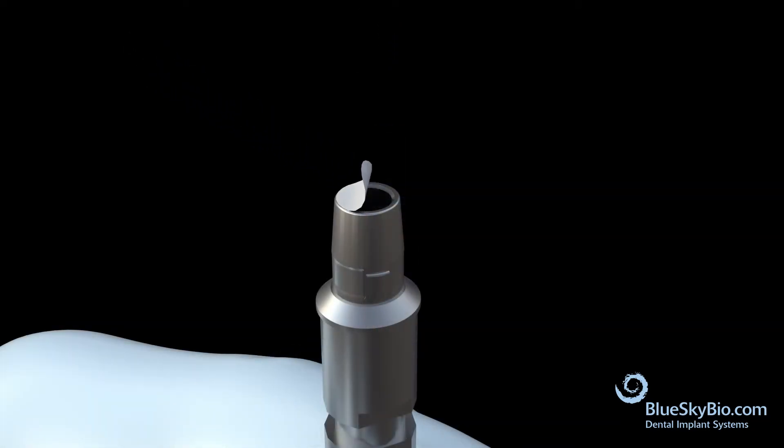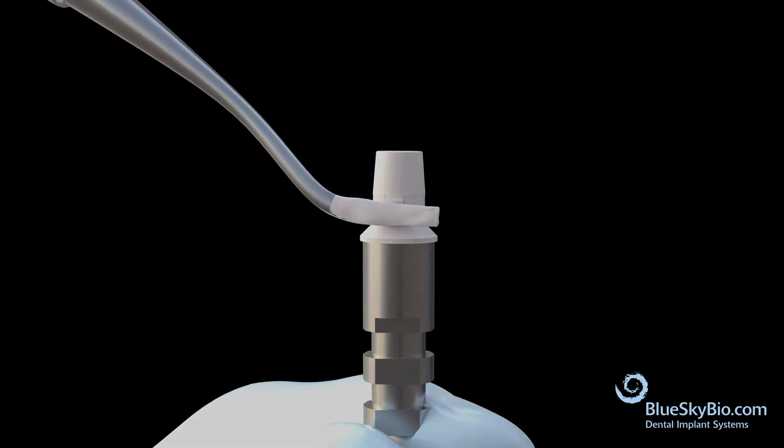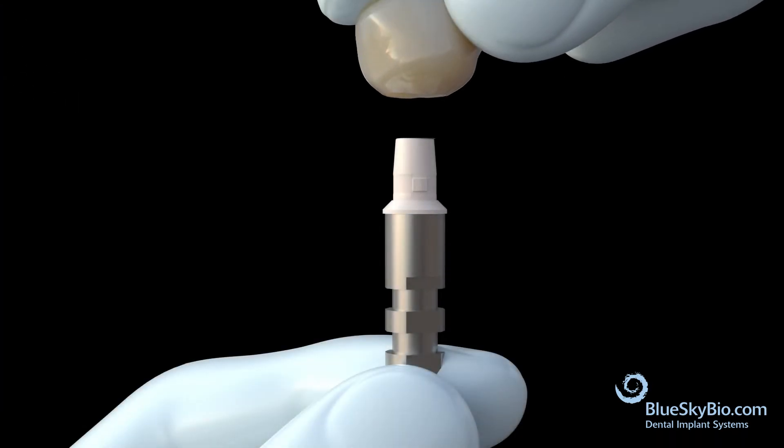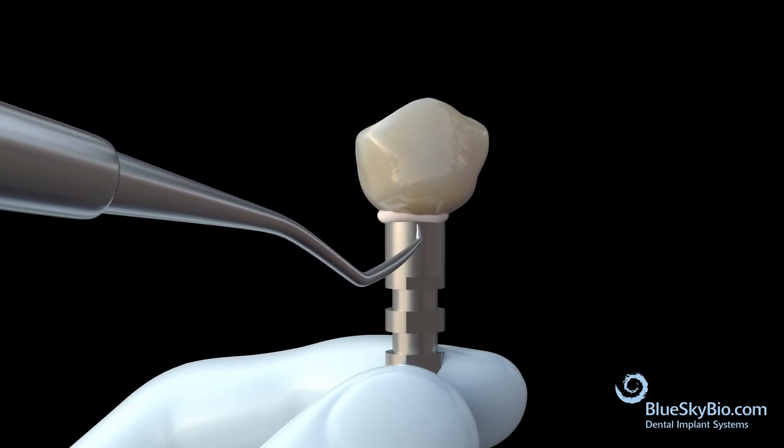Place Teflon tape over the SkyBase digital abutment and apply Multilink or equivalent cement. Attach the crown to the SkyBase digital abutment and remove any excess cement.